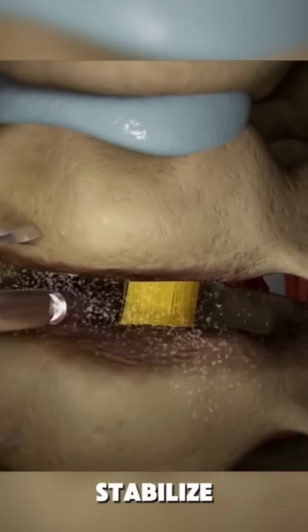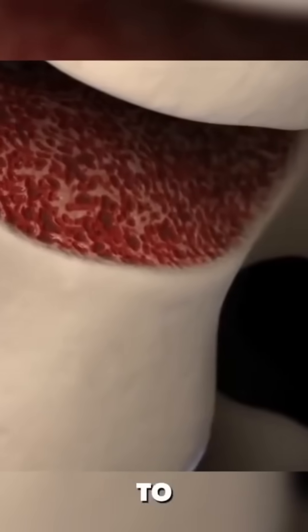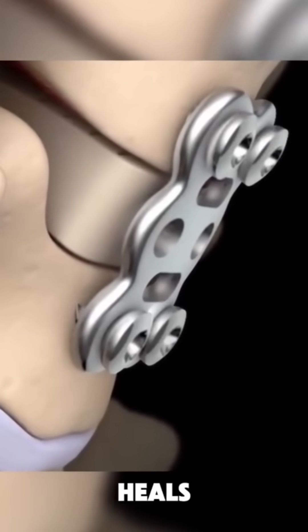Next, to stabilize the spine, the surgeon inserts a bone graft or an artificial spacer where the disc used to be. A plate and screws are added to fuse the bones together, ensuring strength and stability as the spine heals.